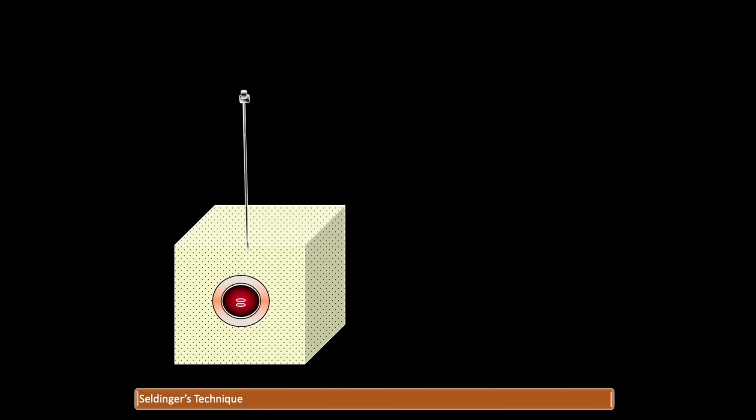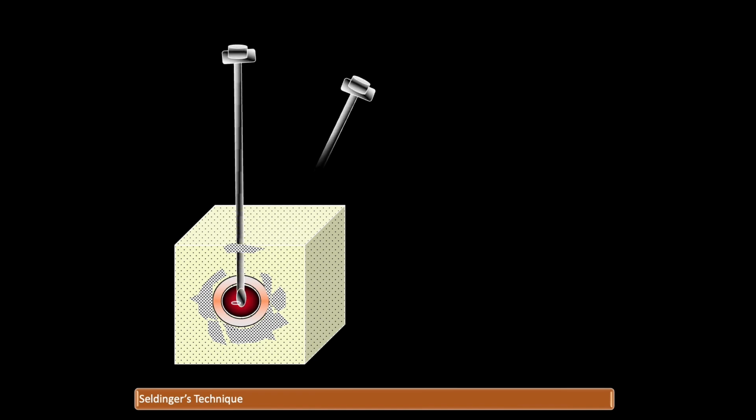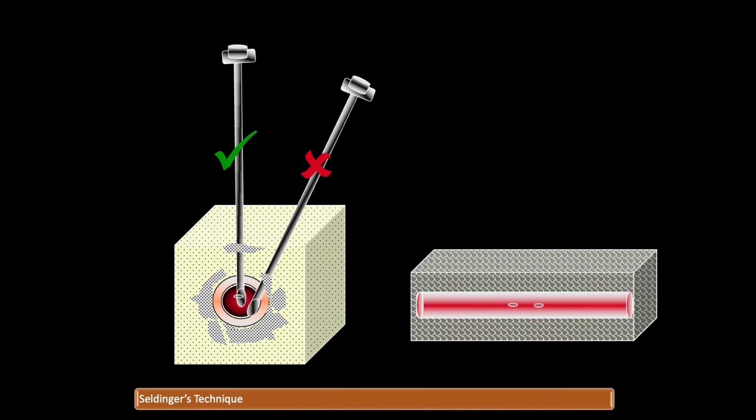So what you do for this, you have to give the local anesthetic. When you are giving the local, you feel the pulse and give only very little local on the front side, directly on the front, and the majority of the local you should give on the sides. So that the artery gets fixed, and then you engage the artery directly, not on the side wall.